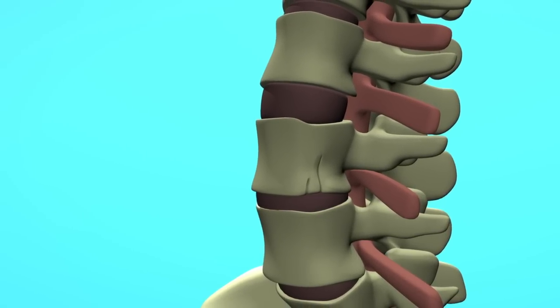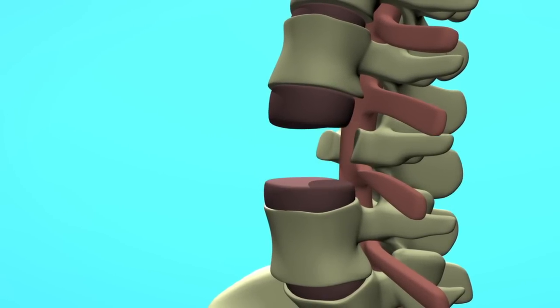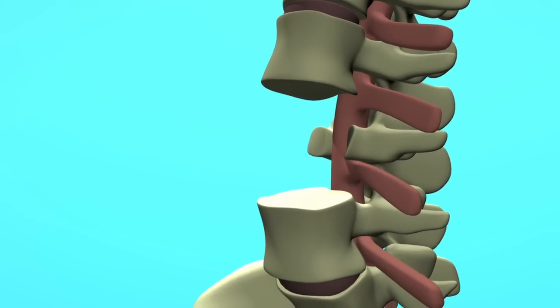The damaged vertebral body is removed, as well as the adjacent intervertebral discs, relieving pressure on the spinal nerve.